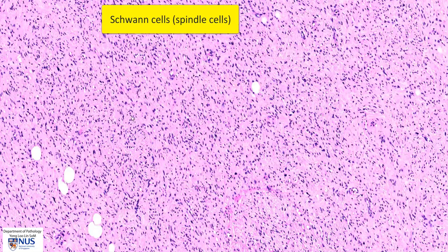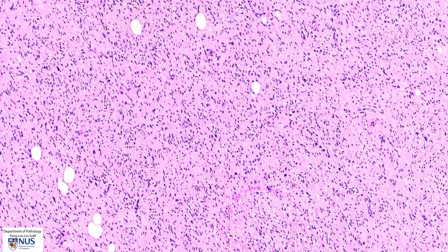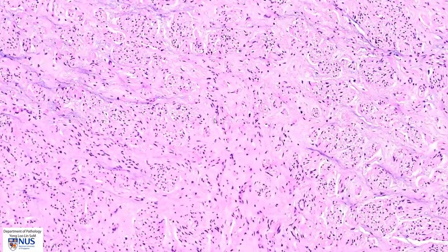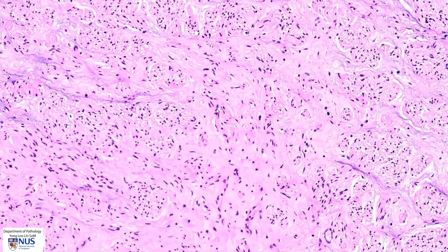Let's have a look at another section from the same tumor, which shows the ganglion cells better. Again, we can see the spindled Schwann cells with very slender, long, wavy nuclei.